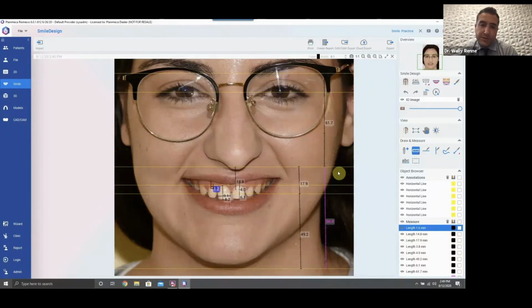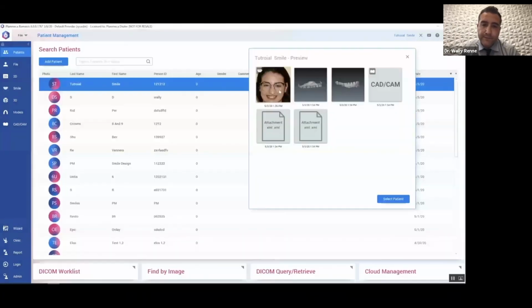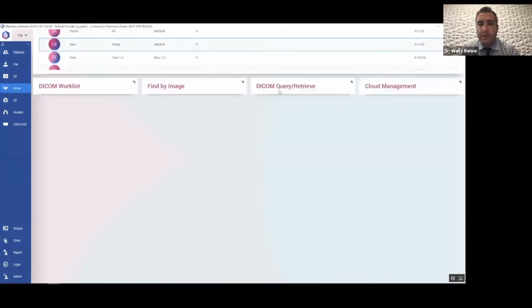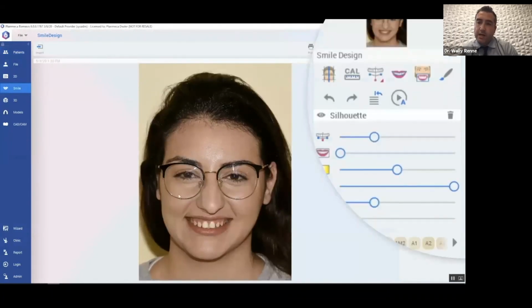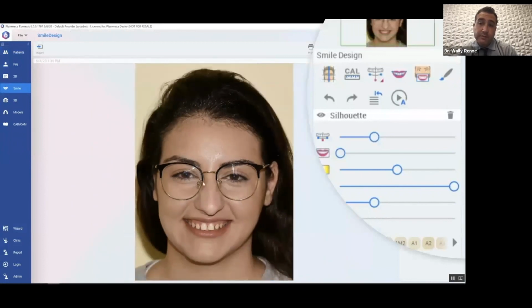So really we focused on the face at first to figure out what's going on. We've diagnosed she has a short upper lip. She has actually a deficient maxilla, not a vertical maxillary excess. And she does not need a Le Fort I osteotomy to move the maxilla up. If anything, we have to try to go the opposite way with this. So let's keep going and see how we go on to now the tooth silhouettes, because that is just half of the equation. So now we're gonna start with the smile shot. Okay, so last time we started with the repose.